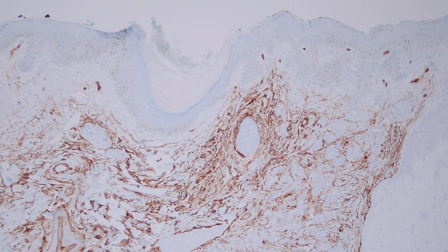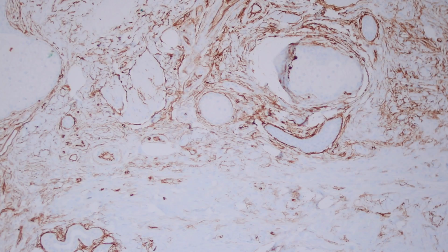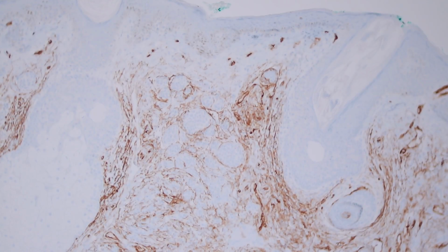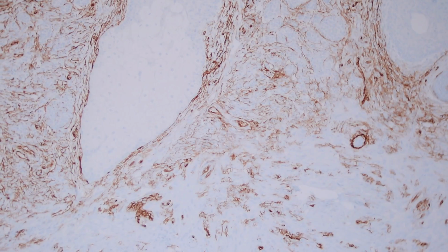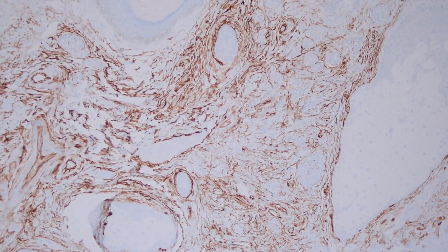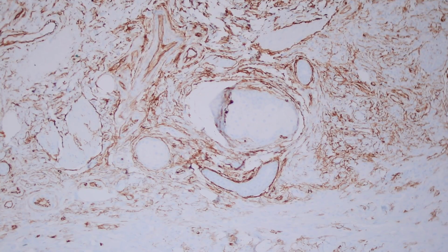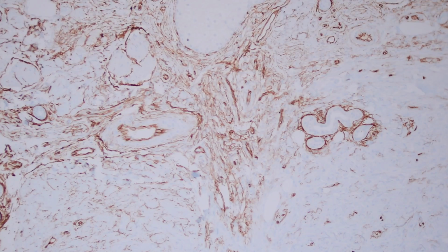So if you try to use CD34 to look for margins on, say, a DFSP, boy, you're going to have a really hard time actually telling apart normal dermis from the tumor itself, okay? And I'll make a video on DFSP at some point in the future, and once I do, I'll post the link down below. So the dermis has a variety of fibroblasts and some dendritic cells, and it picks up lots of CD34, as you can see here. Okay, so that's one thing.